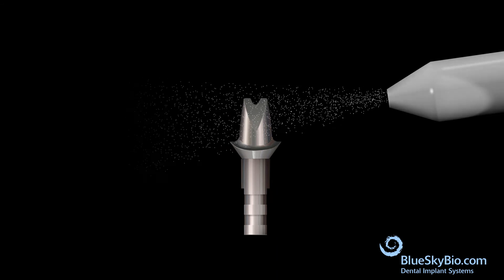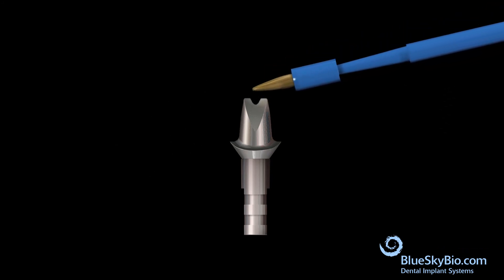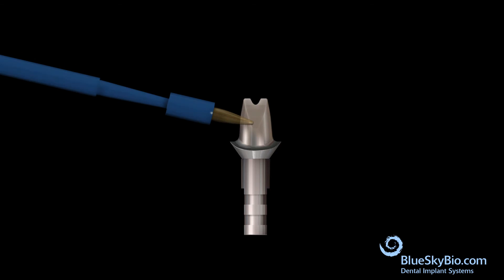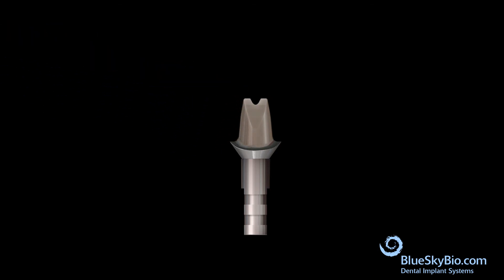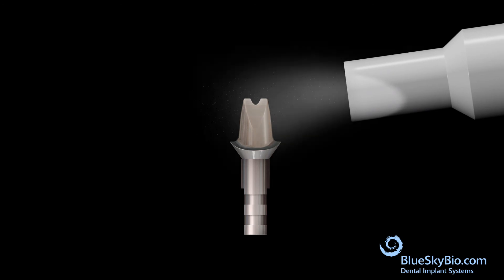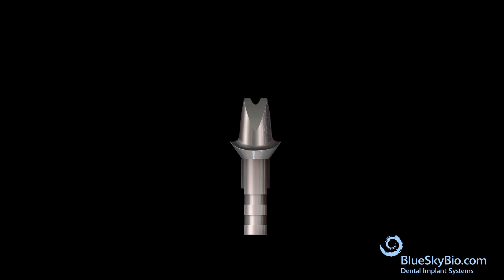Apply two layers of primer agent to the abutment. Air dry the primer agent — the surface will not be completely dry and will stay slightly sticky.